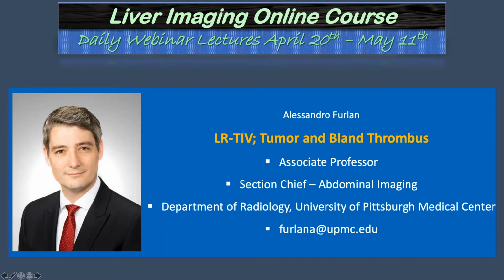Suppose we have an observation which is about 3 centimeters in size. It shows arterial phase hyperenhancement, shows washout, and also has an enhancing capsule on the delayed phases. But it also shows a tumor in vein, which is definitely tumor in vein. So would this observation be categorized as an LR-5 or as an LR-TIV in the final impression of the report?